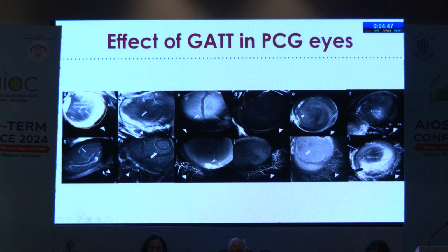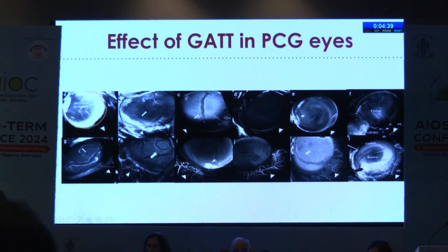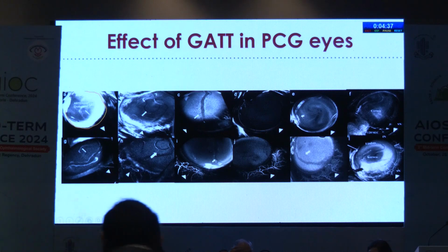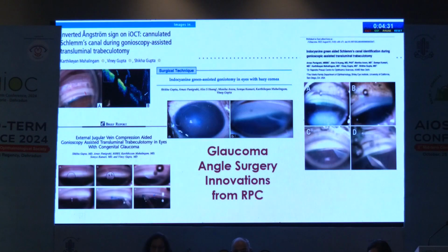And this is the pre and post. These are pre-surgery images of our PCG patients, and there was almost no flow before the surgery. Post-surgery, when we again do an aqueous angiography, we can see increased outflow in the sectors where it was not seen. So the surgery really helps restore the aqueous channels in a timely manner.